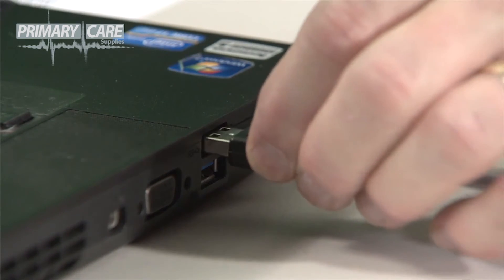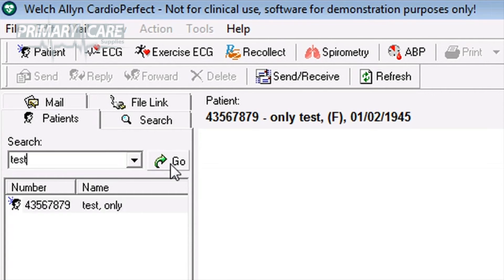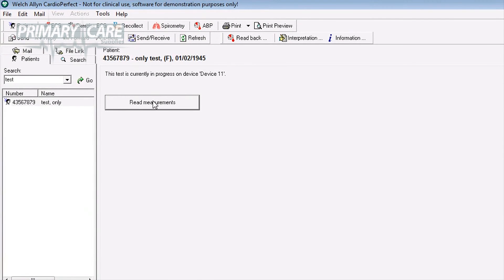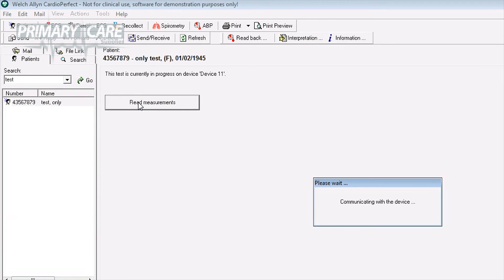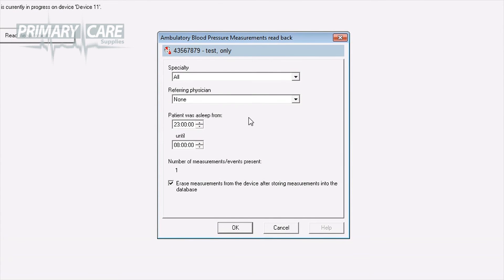To start downloading the results from the unit to your software, plug the USB cable into your PC with the other end connected to your ABPM unit, and go into the CardioPerfect software. Find and highlight your patient's name. In the bottom left-hand corner of the screen, under the heading Type, Date and Time, you'll see the ABP icon and the date and time when the test was set up. Click on the date and time and your screen will display a Read Measurements box. Click on that and it communicates with the device.